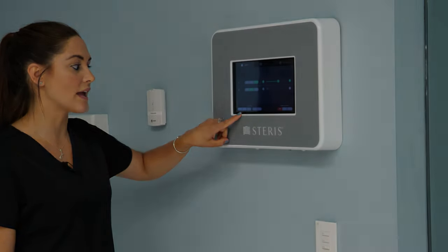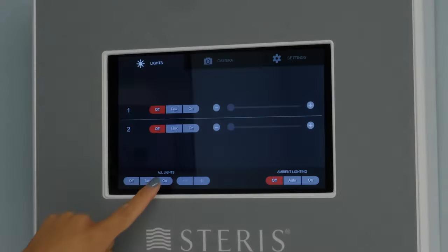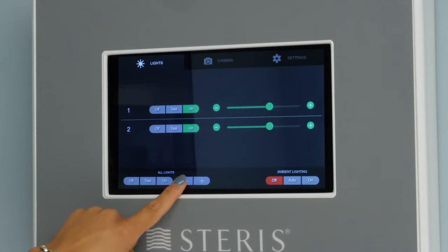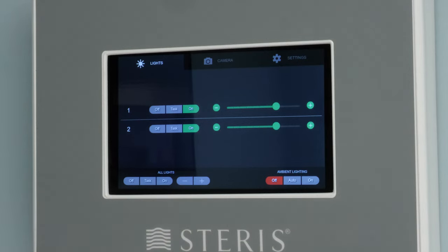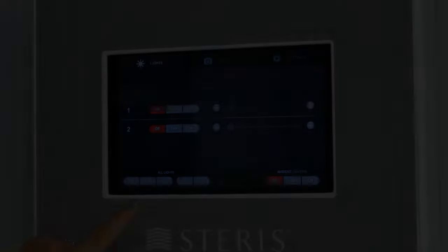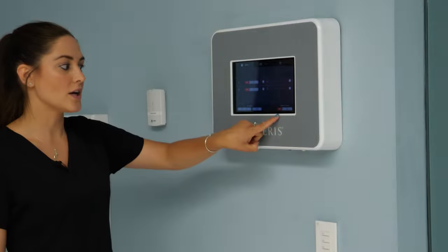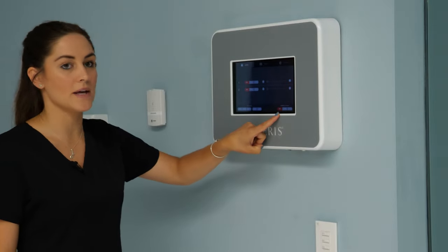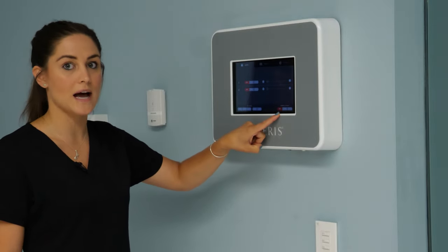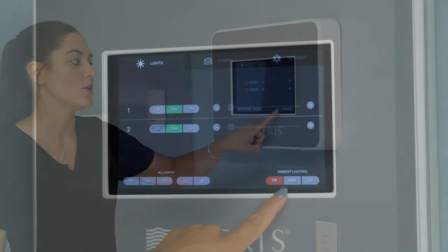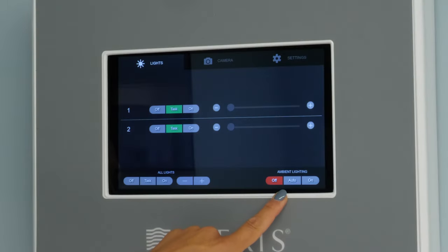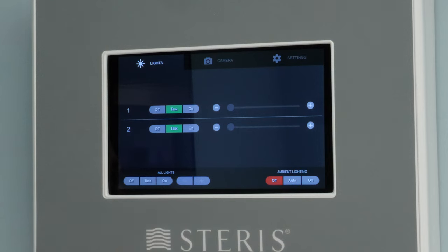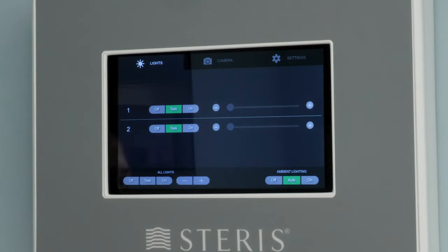To control the lights all together, you simply hit intensity up and down or off. Down here in the lower right corner is the ambient light control, if you purchased this option around your main spindle. You can control it on auto or off. Auto means that the ambient light will turn on when the lights are automatically shut off.